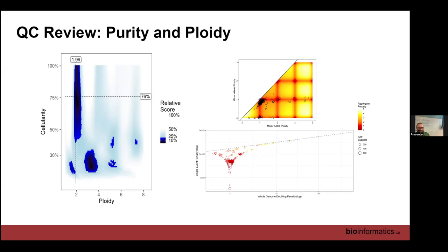If Purple is not well able to estimate what's going on, you'll see examples later where there are many segments not in the high probability regions, scattered all over the place. Here the segments are well clustered together. This genome has some copy number loss, but you tend to have an integer number of tumor-normal copies, which is a good thing to have.